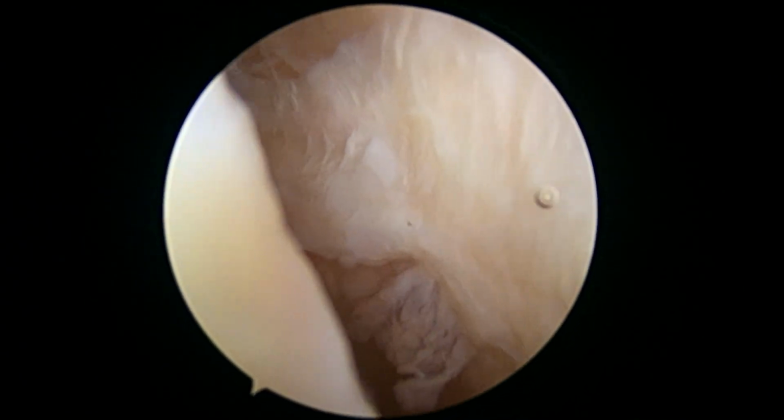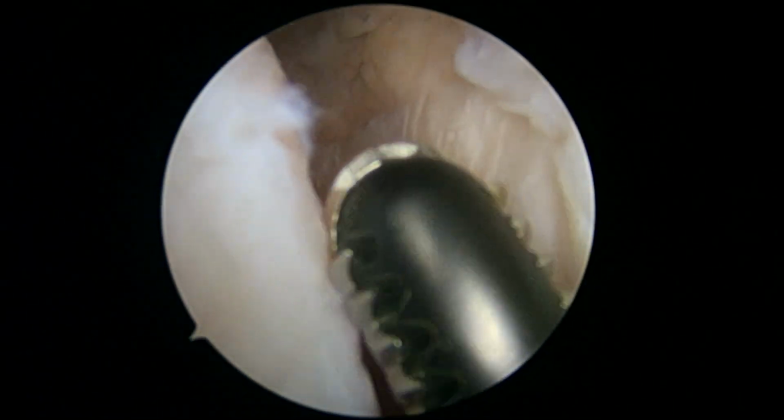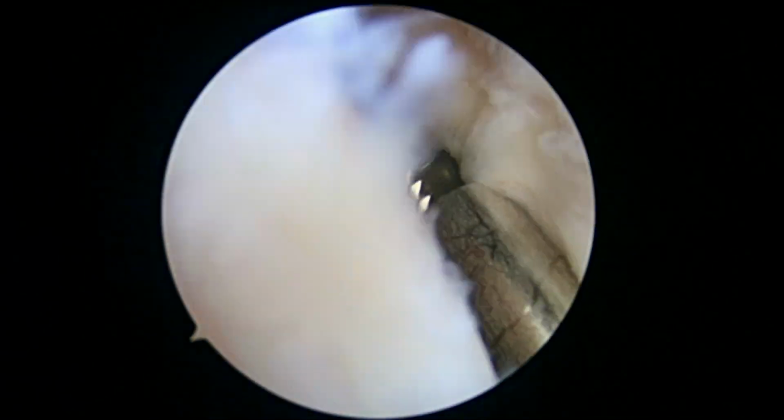Okay, so we're looking in the medial gutter here, because sometimes loose pieces hang out here. We can put our shaver down here. We can even turn on a little bit of suction. And I think we got the one loose piece that was there earlier. Now we're going to come back up here.